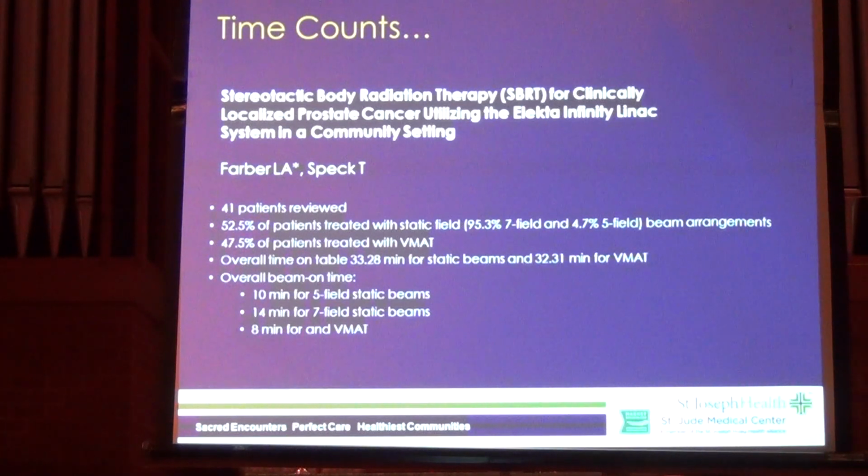You're in the, what's that? We use an Elekta. Other people use Varian. Those are the two biggest machines that are out there. It doesn't really matter so much which machine, but there are some nuances in some of them that allow the dose to be delivered faster. So we're talking about a 5 to 6 minute beam on.